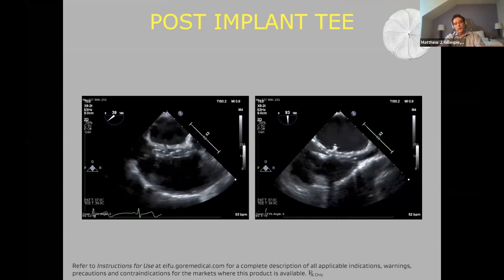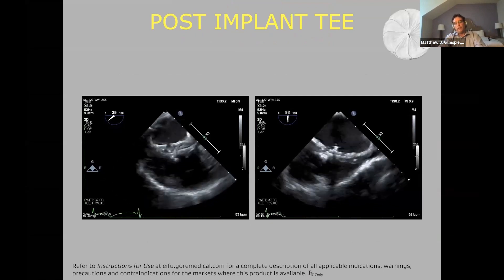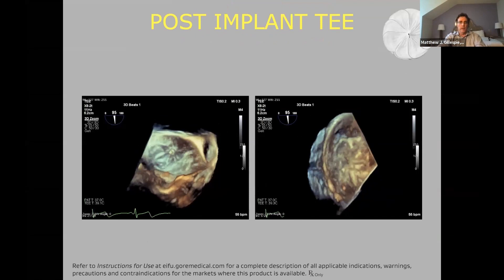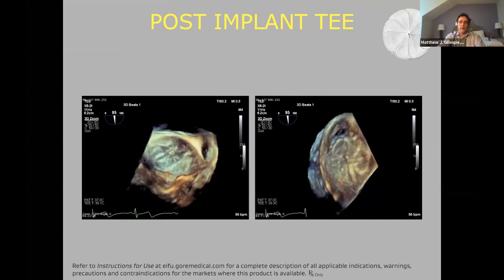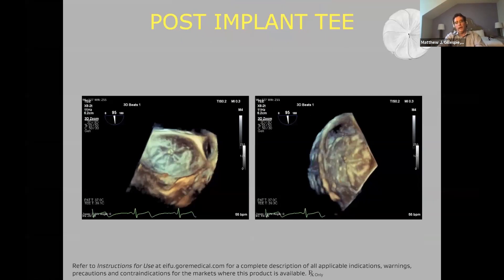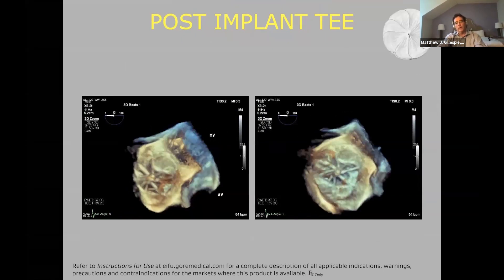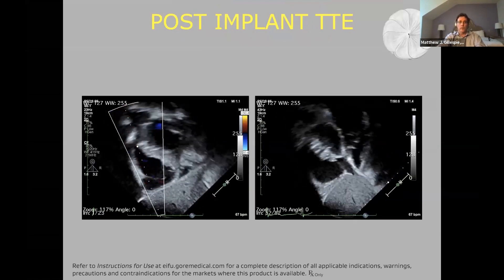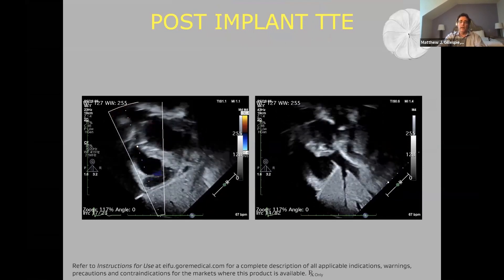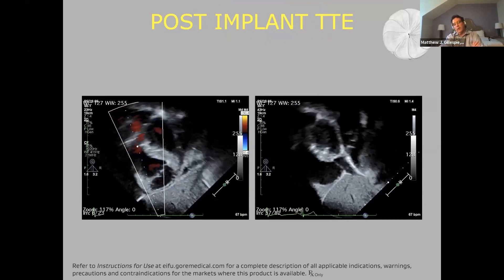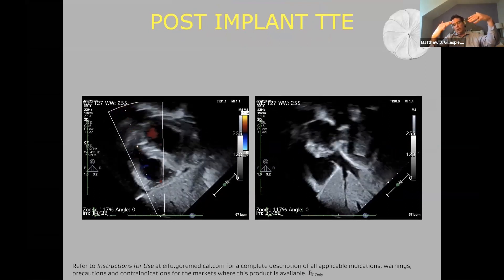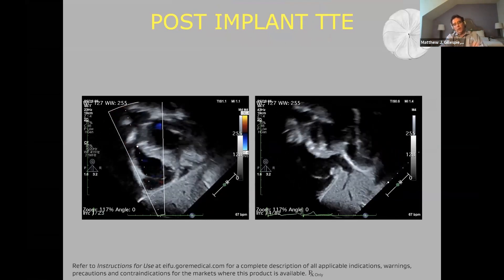This is what it looks like by the rest of the TEE. We also have some 3D images here — the echo people love this. The LA disc is on the left-hand panel and the RA disc is on the right. It's a very nice result for this patient. This is what it looks like by transthoracic echo the next day — you can see the device right in the septum, still looking like it's bowing slightly from LA to RA in plane with the atrial septum.